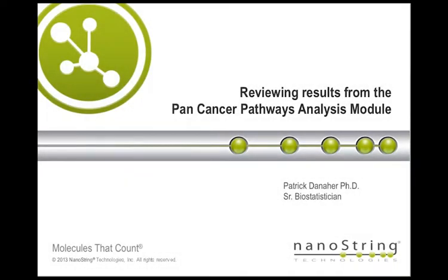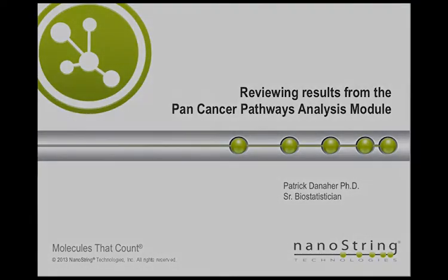Welcome to this webinar, in which we'll explore in detail example results from the Pan-Cancer Pathways Analysis module. This is the same dataset that was included with the download of nSolver 2.5 and described in the Pan-Cancer Pathways Analysis module white paper. You can use this data to replicate the analysis in the white paper. The results I show here may differ from the white paper based on different analysis options selected.